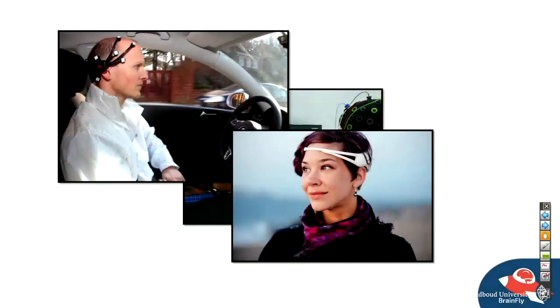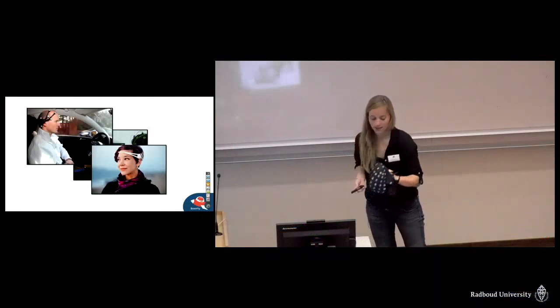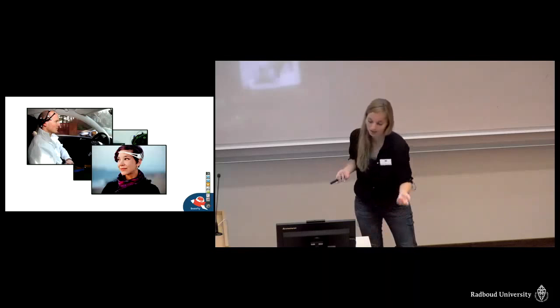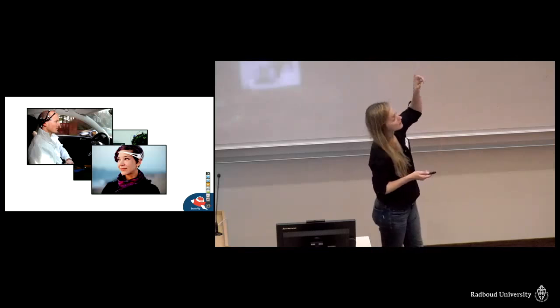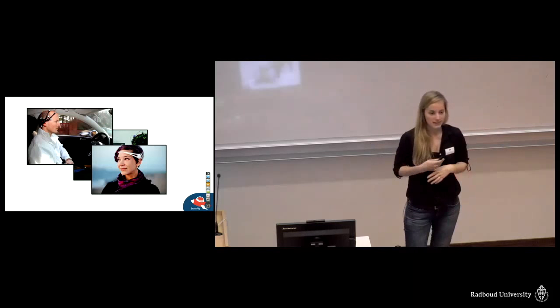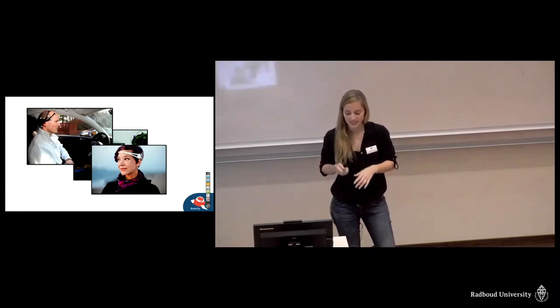And then it's not only in a research environment. As you see with the first picture, it was quite dense, just like this one. A lot of effort to put on. So someone at home would have trouble with this. But it's getting more and more to the consumer market. As you can see here, there are fewer electrodes, but it's already being used. You can play easy games with it, or make a ball float, or move something slightly.